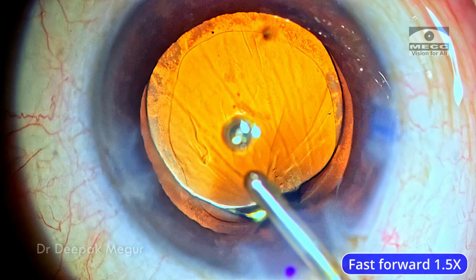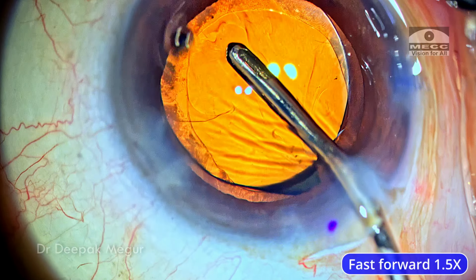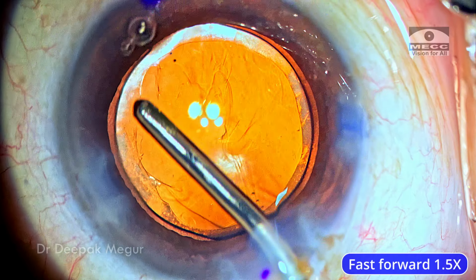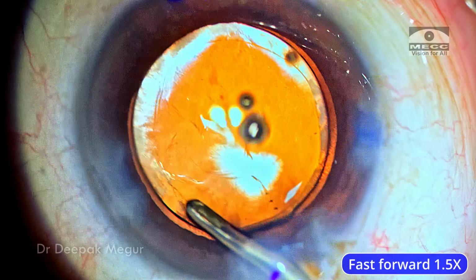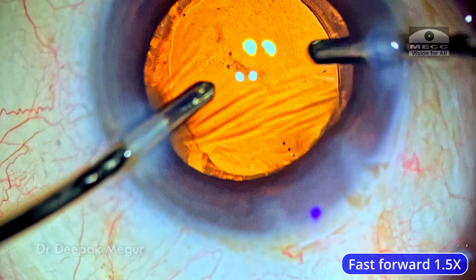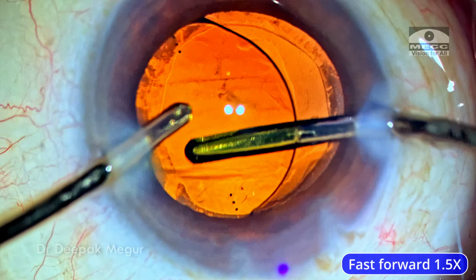And as the aspiration begins and the OVD is getting evacuated, gradually my assistant is going to increase the bottle height. Now it would have gone to 50 centimeters and now it would have gone to 60 and 70. So this gradual increase in the bottle height ensures that we don't have a sudden increase in the infusion pressure. It also is less detrimental on the posterior capsule, and also the patient is much more comfortable.